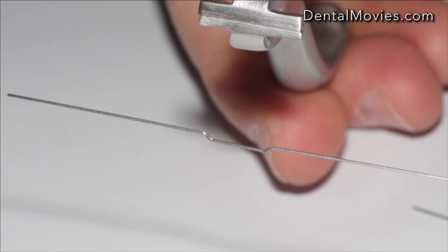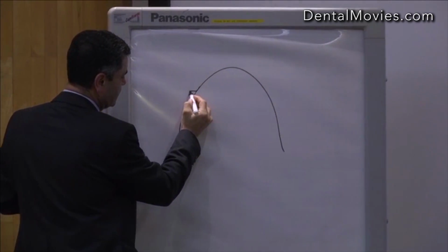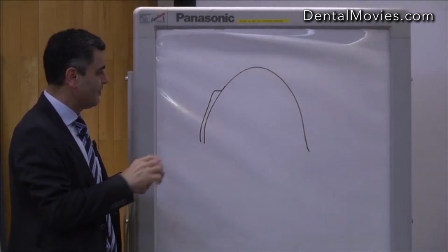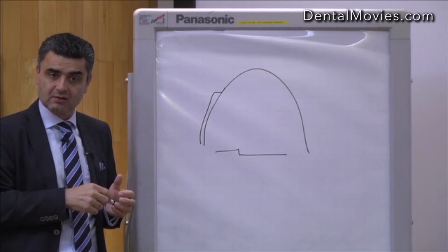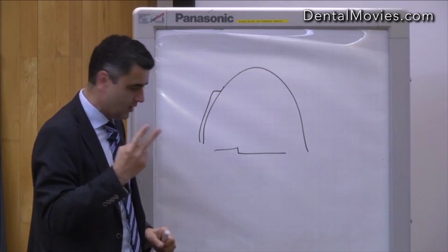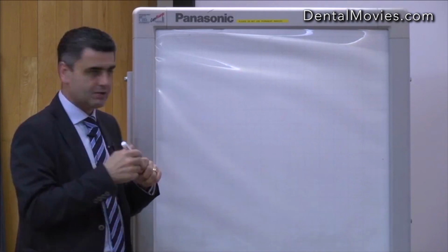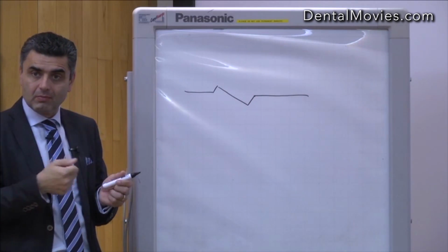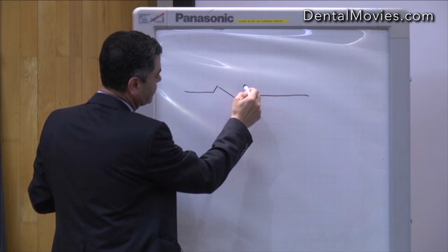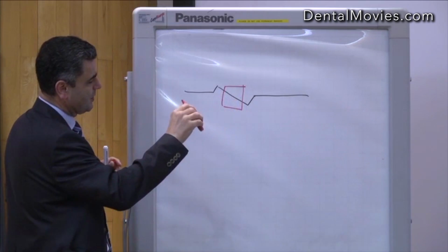You can also use it, rather than press this way, press that way, and it's going to give you the offset. So first order bend plier, in the case we're looking at now where there's a cross bite, we'd like to do that. You see? Okay. But if you turn the plier this way, you could also do that. Yeah? So it's for vertical and transverse bends. First order bends. Yeah? Now, second order bend. A second order bend, the correct term is known as tip. Right? So, a second order bend, which can also be done with a Jaraback. If you now have your bracket, what is that going to do when that goes into the slot?